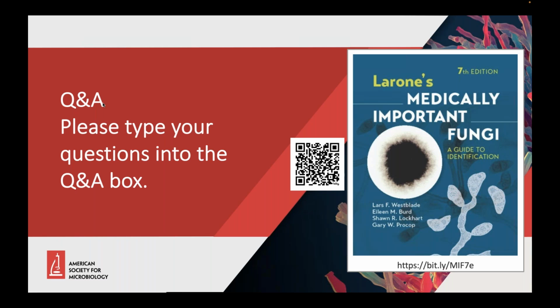All right, moving on. For Candida auris, the CDC's standard recommended culture-based method is still salt dulcitol. With Candida auris on the rise, we're being asked to stand up testing, and we'd like to use culture versus a PCR approach. Are there any studies or anecdotal evidence you know of comparing a CHROMagar versus salt dulcitol approach?